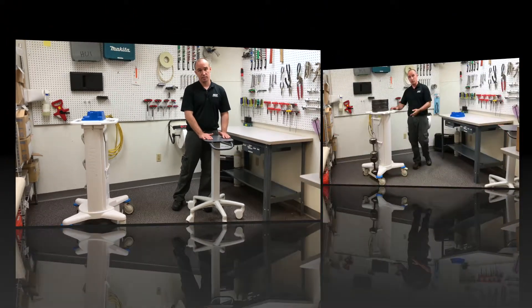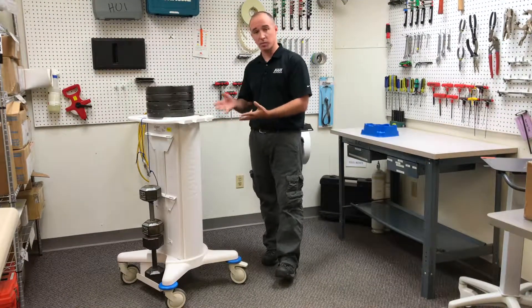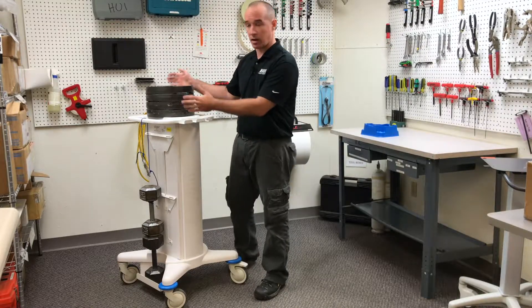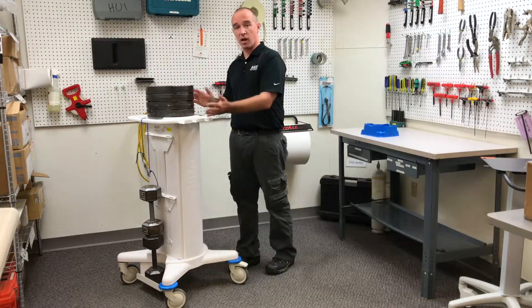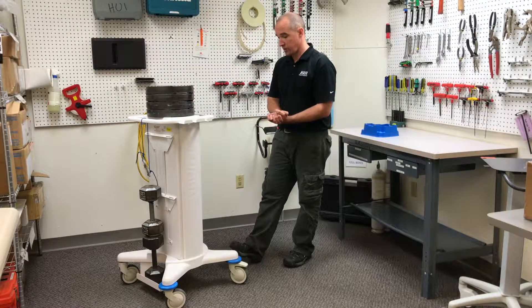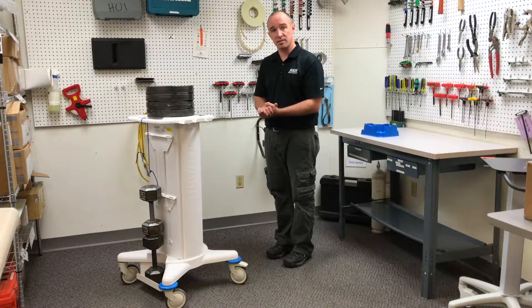So let's run the test. The materials required to fully load this cart weigh about 37 pounds, so multiplying by four, we get almost 150 pounds — 50 pounds on the back and 100 pounds on the top. We gradually apply the weight onto the cart. Once we have it there, we need to wait a minute and make sure there's no unacceptable risk, and if there isn't, the cart passes.